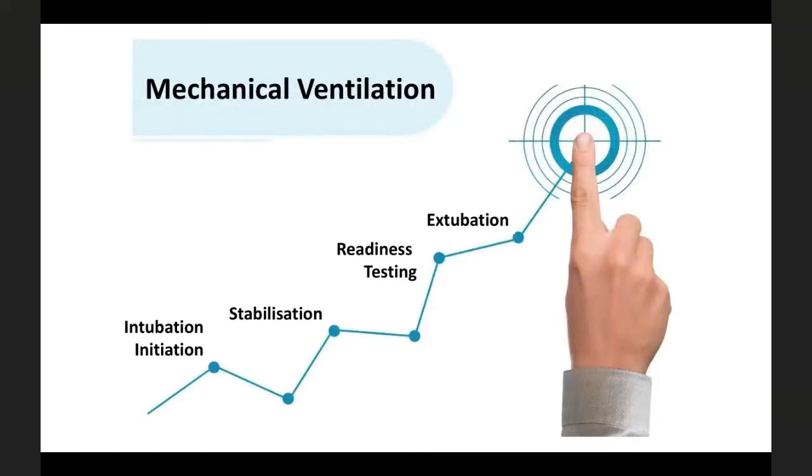Mechanical ventilation, we are all familiar with how to initiate right from the time of intubation, how to do the pre-use check. Then you proceed to the stabilization phase. And once stabilization is done, you start with readiness testing for extubation. So you don't want your patient to be on mechanical ventilation indefinitely. That is just to keep the physiology going, to support the systems. As soon as possible, you try to take off that invasive mode of life support system.